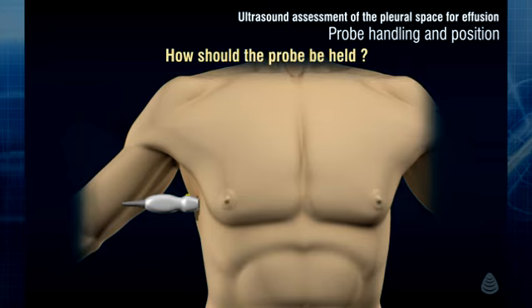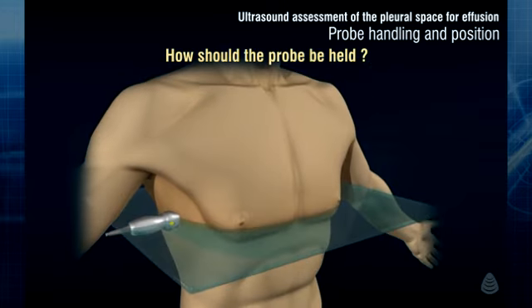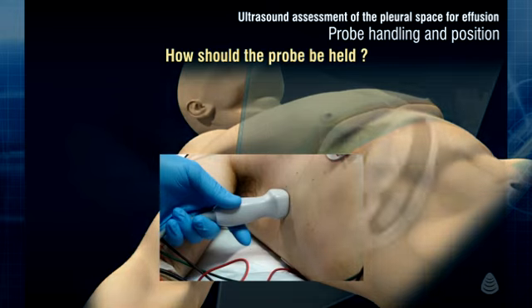Pleural space imaging should preferably not be performed in the transverse, also called axial plane, as this plane does not provide as much information about the relative position of the surrounding organs. Transverse imaging of the chest is performed by holding the probe in the intercostal space parallel to the rib, with the index mark pointing towards the ventral or anterior aspect of the patient. The resulting view provides the same plane of imaging as that obtained by a CT scan.